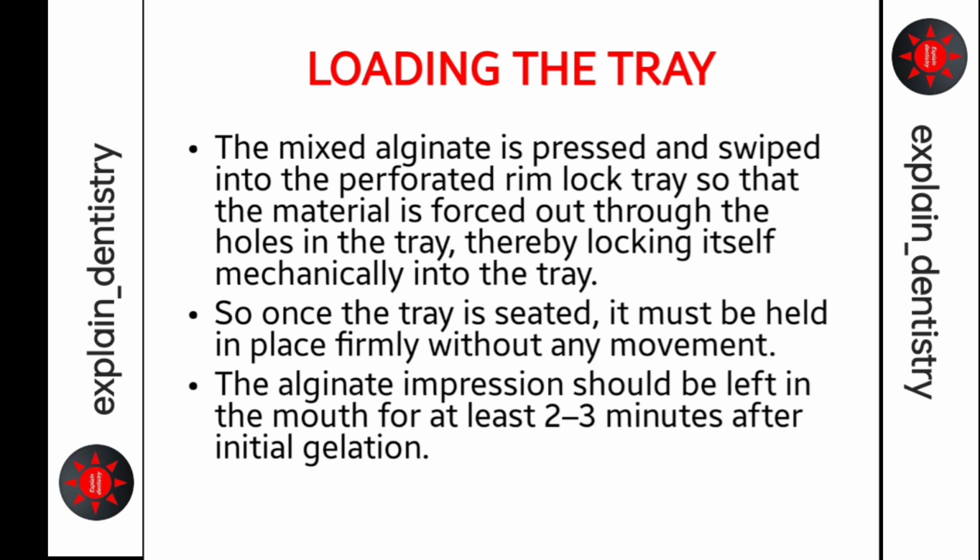Loading the tray: the mixed alginate is pressed and swept into the perforated rim-lock tray so that the material is forced out through the holes in the tray, thereby locking itself mechanically into the tray. Once the tray is seated, it must be held in place firmly without any movement. The alginate impression should be left in the mouth for at least 2 to 3 minutes after initial gelation.